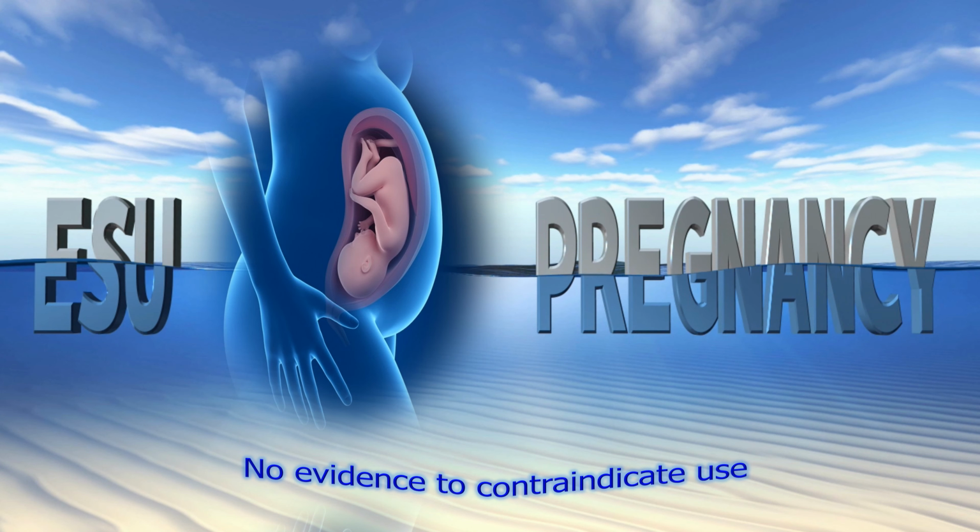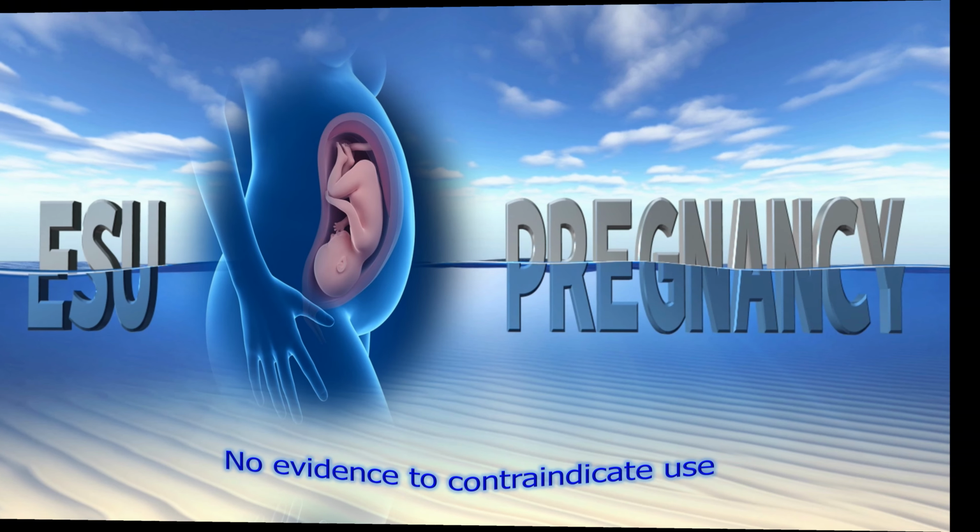Regarding use of the electrosurgical unit during pregnancy, there is no evidence to contraindicate its use. Dispersive amniotic fluid protects the fetus from concentration of electrical current. There is no risk of neuromuscular stimulation above 100 kHz. So it can be used during pregnancy.